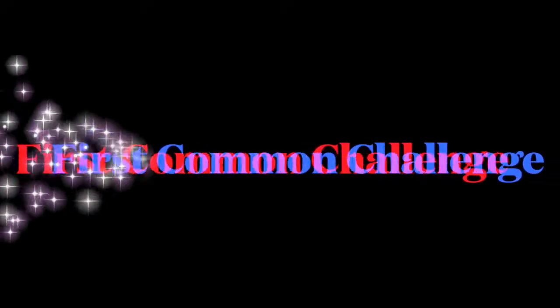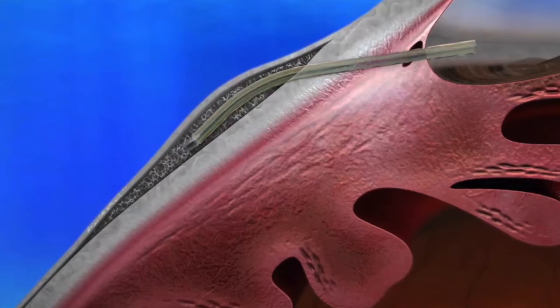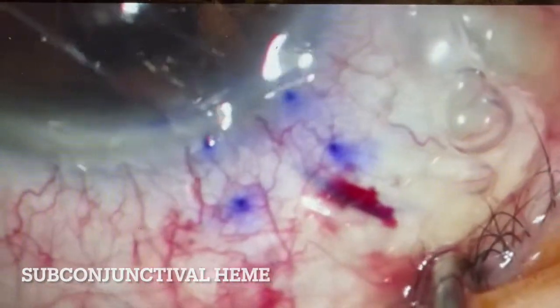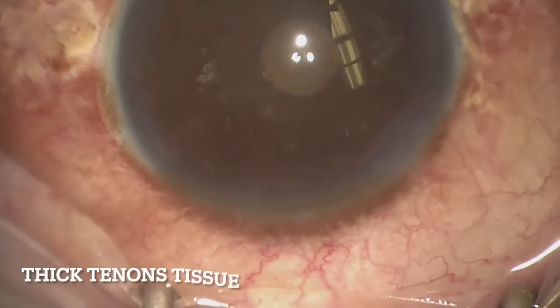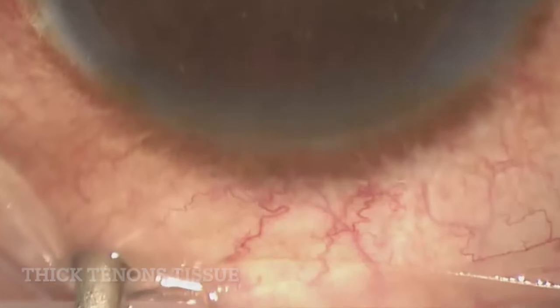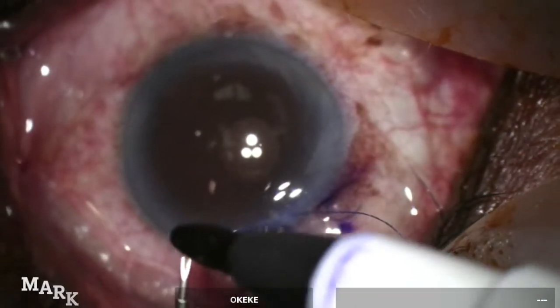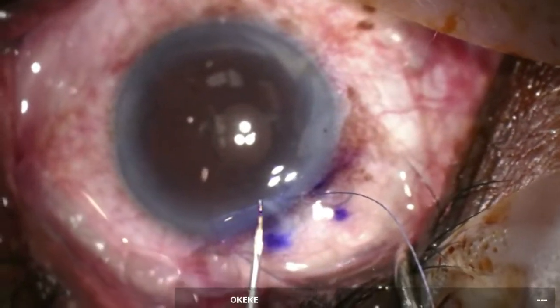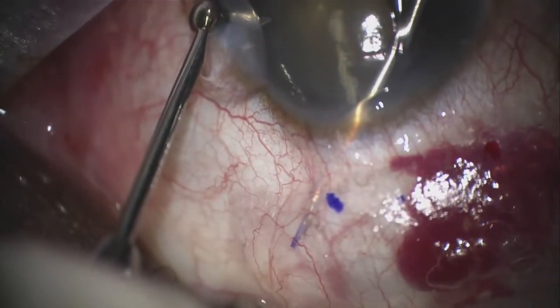A common challenge seen with this device is difficulty seeing the Zen Gel Stent tip after insertion under the conjunctiva. Sometimes there can be subconjunctival heme, conjunctival melanosis, or thick tenons tissue which can obscure the view of the tip. A simple solution is to darken the tip of the Zen Gel Stent with a marking pen prior to insertion to help easily identify the location of the stent under the conjunctiva.